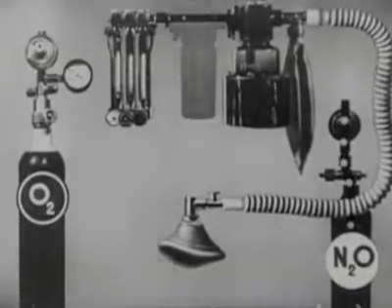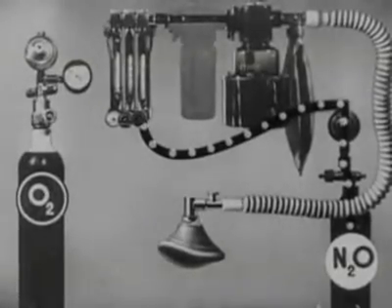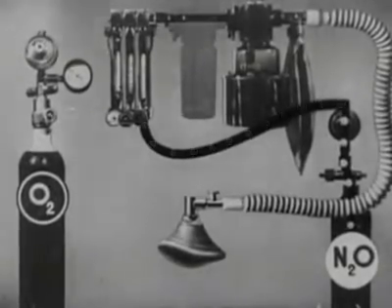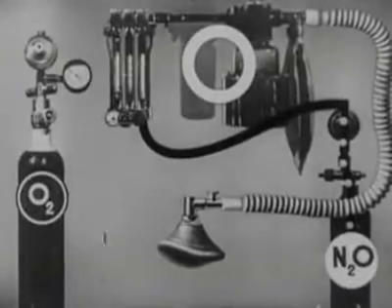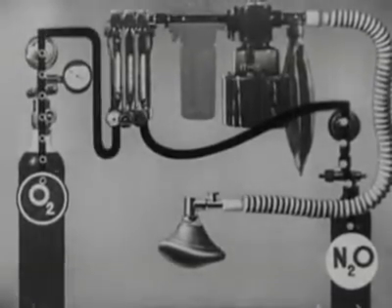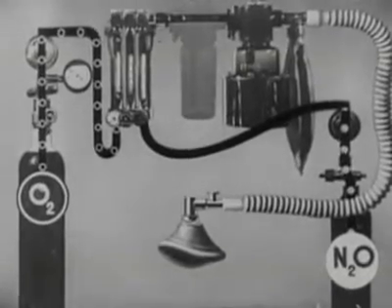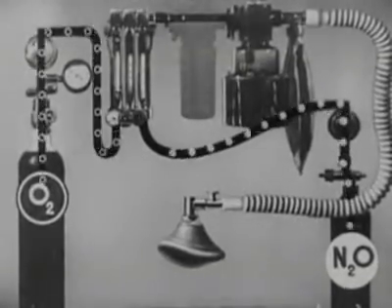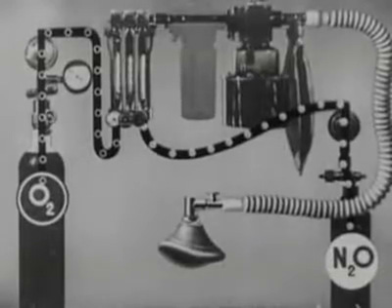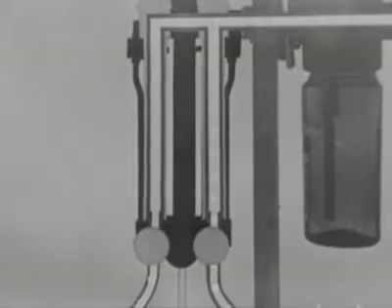The gas flows from its cylinder through the lead to the flow meter. The symbol for oxygen is a white ring. This also flows to the appropriate flow meter. Here are the two gases flowing together as far as the meters. Next, they pass through their respective flow meters.